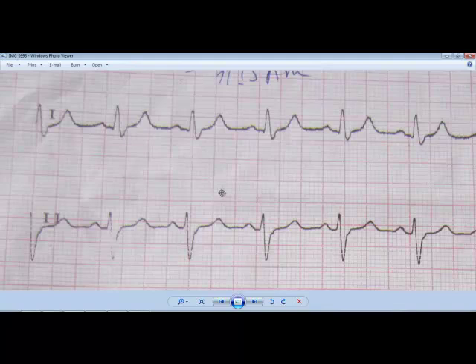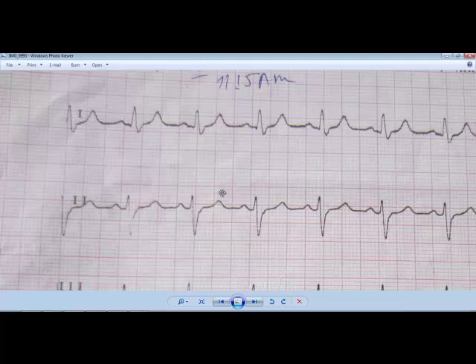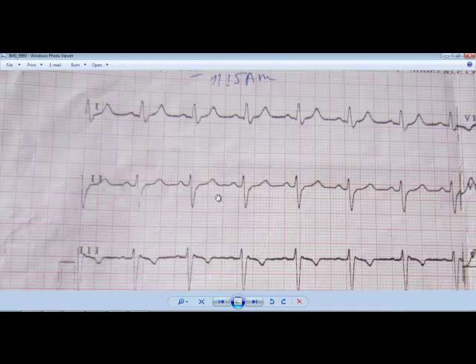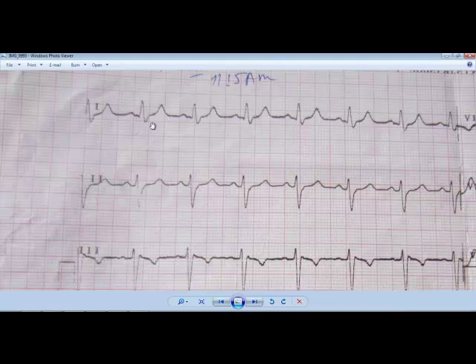I'm not going to calculate the axis here, but I can show you how to see whether it is left axis or right axis without calculating. You can simply look at the largest positive wave in leads 1, 2, and 3. If the largest positive wave is in lead 2, it is a normal axis. If it is in lead 1, it is left axis deviation. If it is in lead 3, it is right axis deviation. This method gives you a probable idea of axis deviation — it is not absolute, but it works very well.